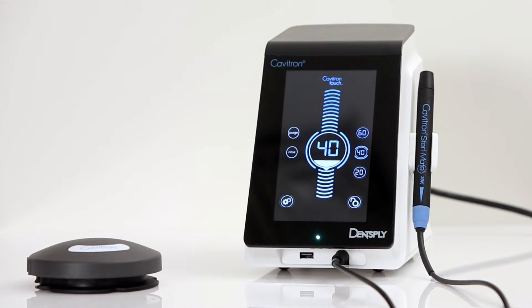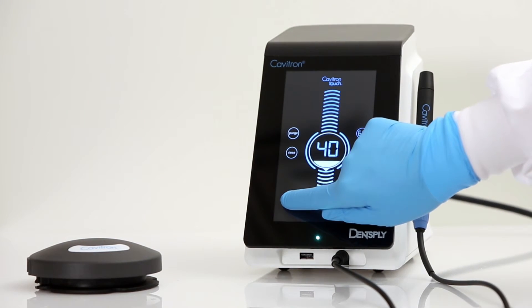The main screen will appear. This is also referred to as the scale screen. Please remove any inserts from the handpiece. Next, press and hold the settings icon until the settings screen appears.